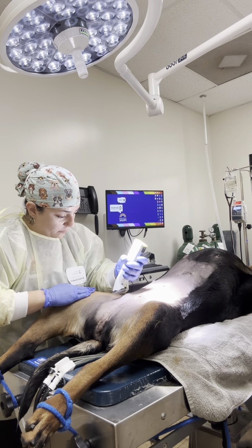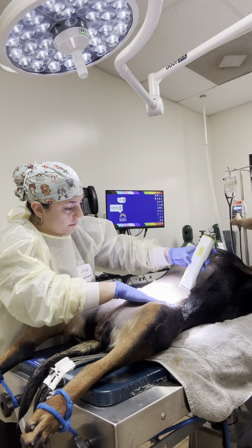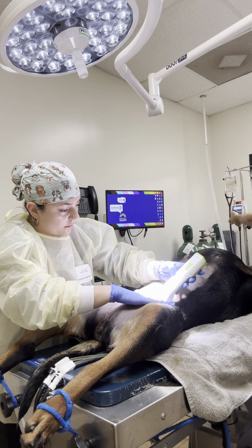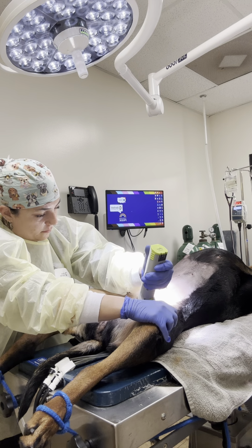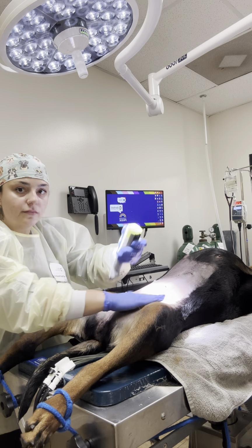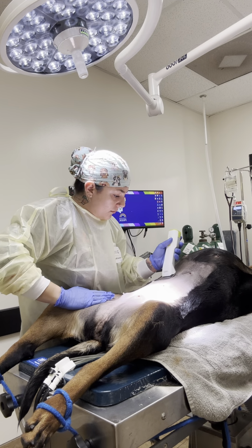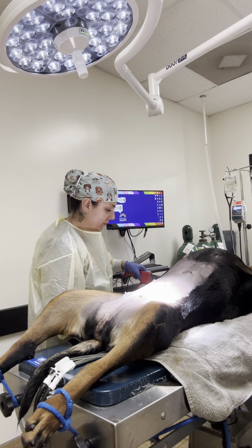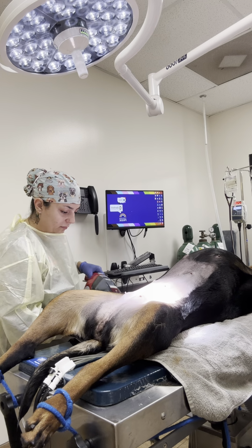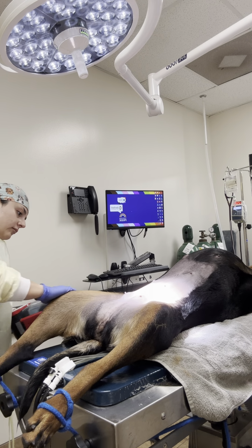How do I change this? You just type in the number and then hit start, the green button. Tachycardia is the only downside. So I find getting the smallest of like a quarter dose, if you will, that first half ml, and being able to sit on the glyco for 5 minutes is honestly your best medicine. But neither you nor I felt like we had that. Right.